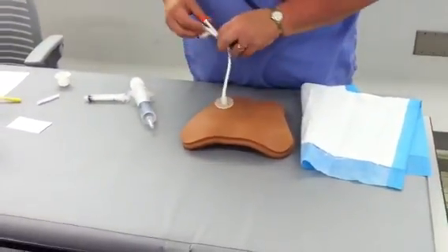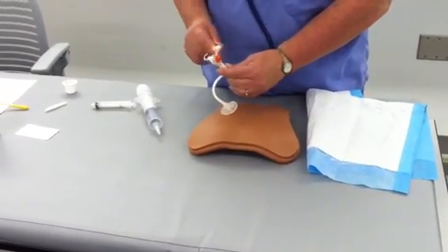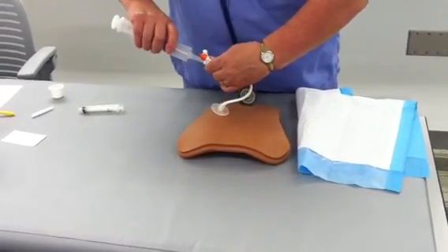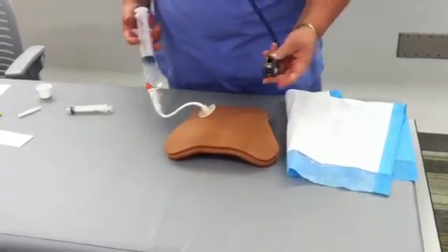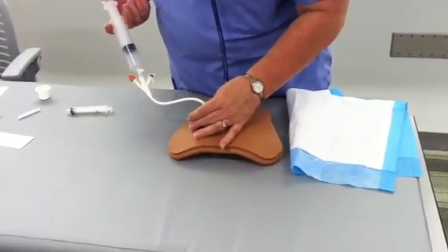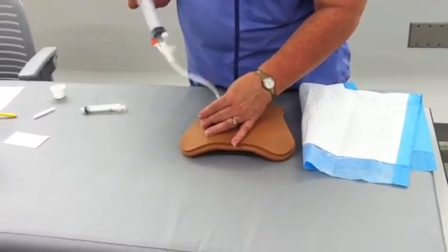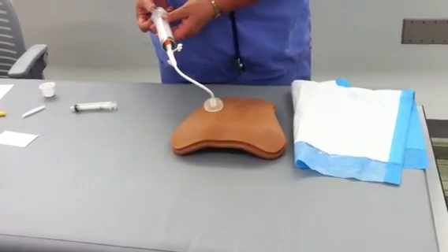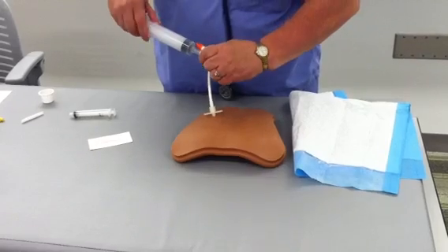Left upper quadrant, right? So before I uncap the tube, I'm going to make sure and pinch it. And then I'm going to hook up the syringe, and when I hook up the syringe, I'm going to push it in and give it an extra little twist. Then I'm going to put the stethoscope, and if they have a G-tube, obviously you put it right by the G-tube because that's where the stomach is. Then I'm going to push it in fairly quickly, and I'm going to listen for a whoosh. So I heard the whoosh. Then I'm going to pull back, and if there's pH paper available, I'm going to check the pH.